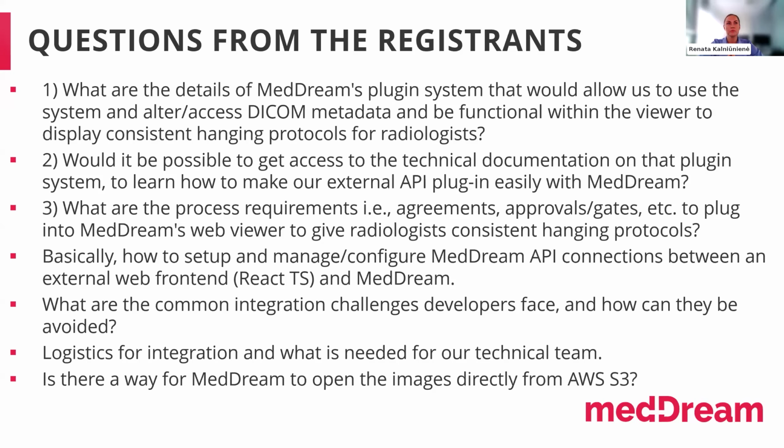Okay, thank you. So I'm reading the next one. Would it be possible to get access to the technical documentation on that plugin system to learn how to make our external API plugin easily with MedDream? Yes, so in our slides, I have presented this documentation already.